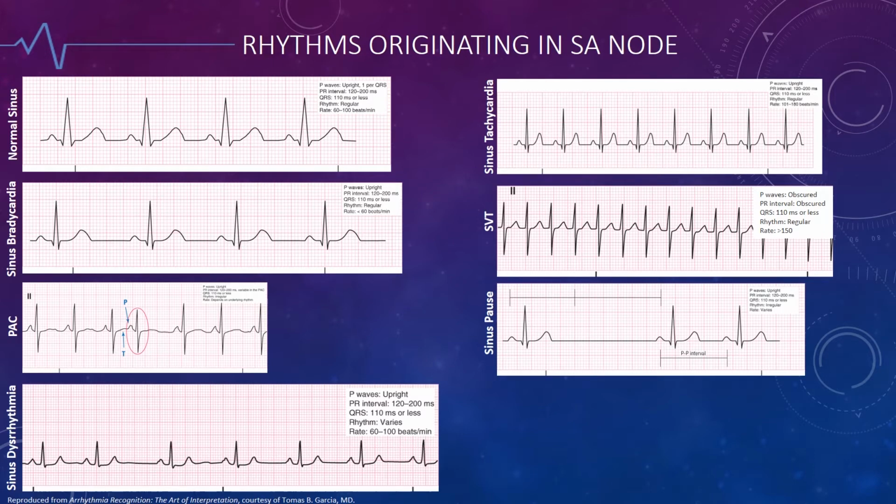All right. Supraventricular tachycardia is a narrow complex rhythm in which you cannot see the P waves. This is not the accurate definition. This is not the precise definition that someone who does what I do wants for supraventricular tachycardia, but it will get you the right answers on your tests, your boards, and in the rig. Very fast rhythm, narrow complex, can't see any P waves. Give that patient adenosine, see what happens. Half the time it'll go away.